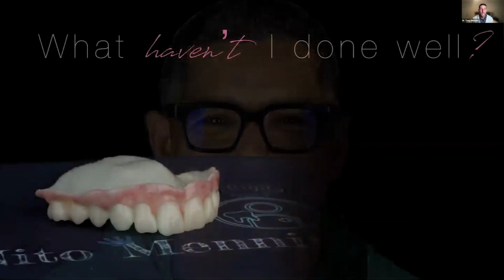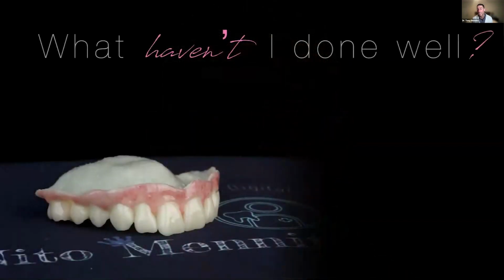So the convenience of long-term provisionalization for 3D printing is immense, and we do it all the time. We do a lot of cases, bigger cases like this, where patients are in provisionals for a decent amount of time, and I love these materials for that. So that is one of the things that I really, really like about our 3D printer. What haven't I done well in my practice?